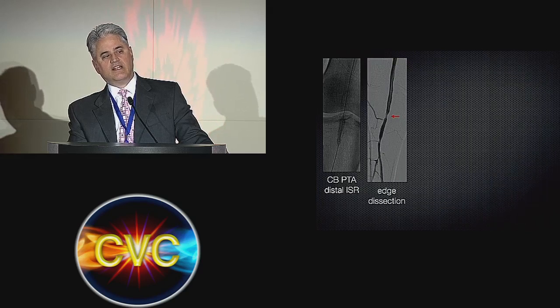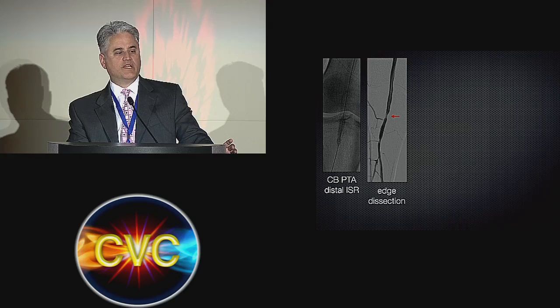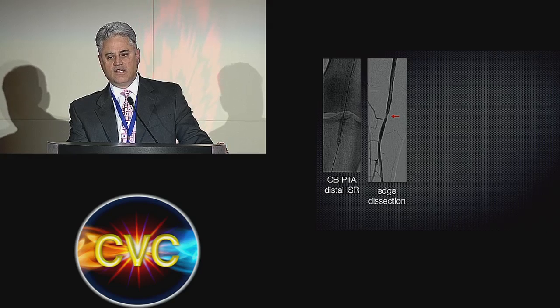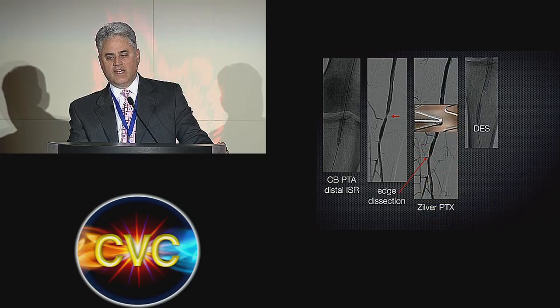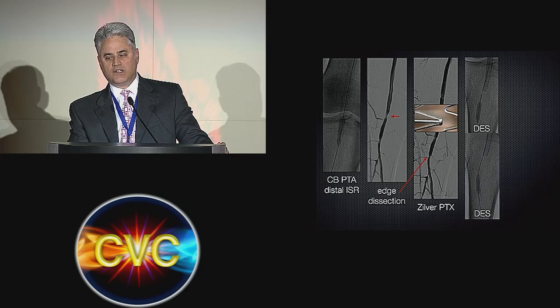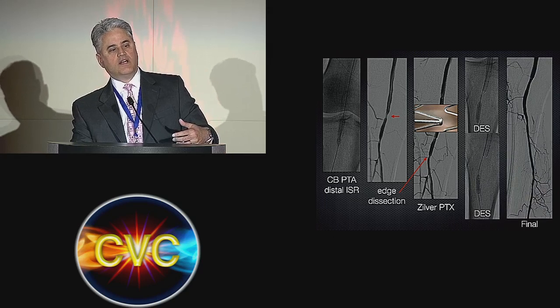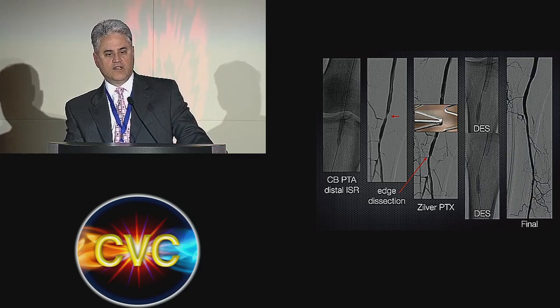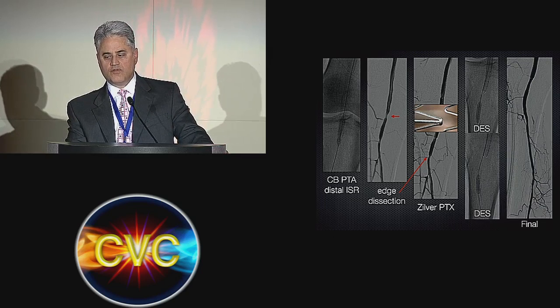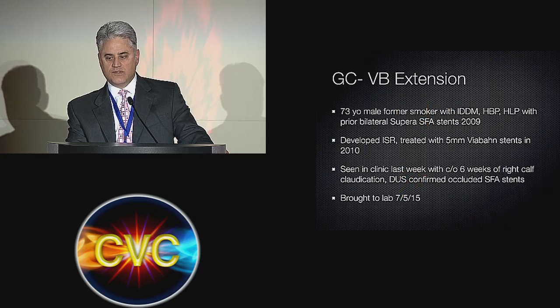Now, distally, she had a lot more disease. I didn't feel comfortable because of the size of the vessel putting in another covered stent, so we put in a Zilver PTX. You can see there is some disease distal to that, and we did elect to treat that with drug-eluting stents. You know, the DESTINY trial was a randomized trial which did show very high primary patency rates with drug-coated stents in the tibial vessels of over 85%, and so we use that here.